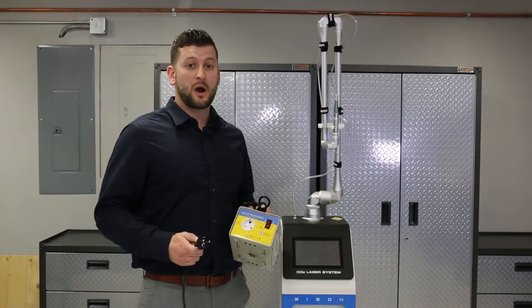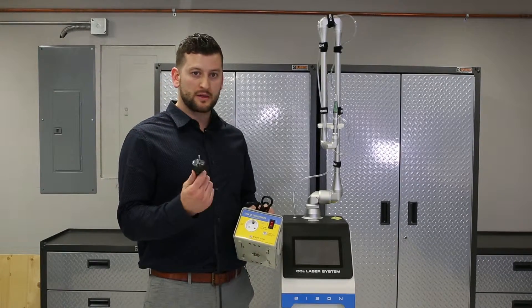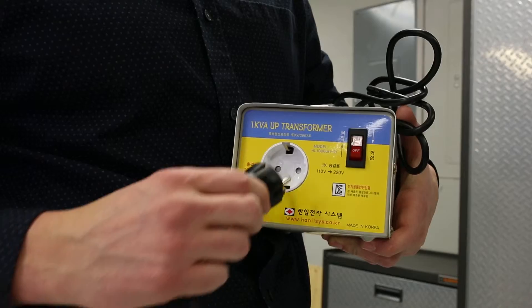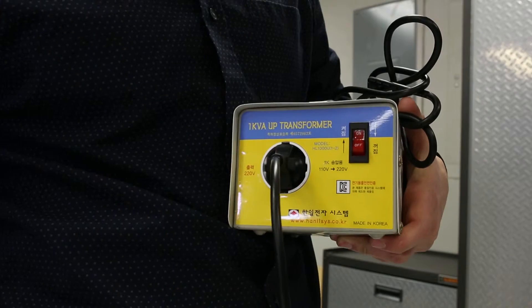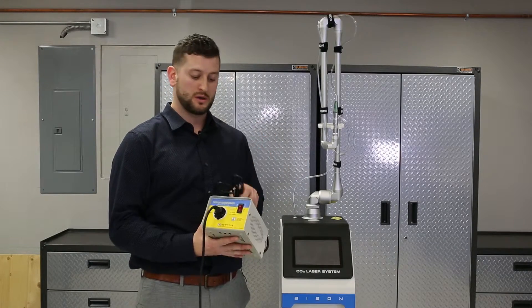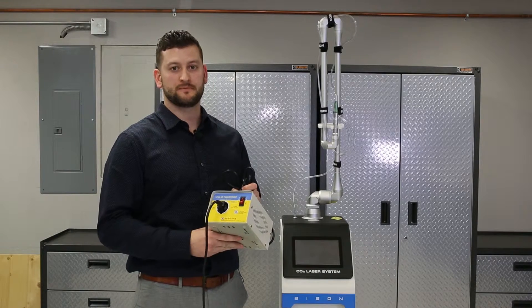Just plug the power converter into the Bison Laser. That other end has a 220 plug — it needs to be plugged into this power converter. This will convert it from 220 into 110. Plug this end into the wall, make sure that the switch is on, and you're ready to go.